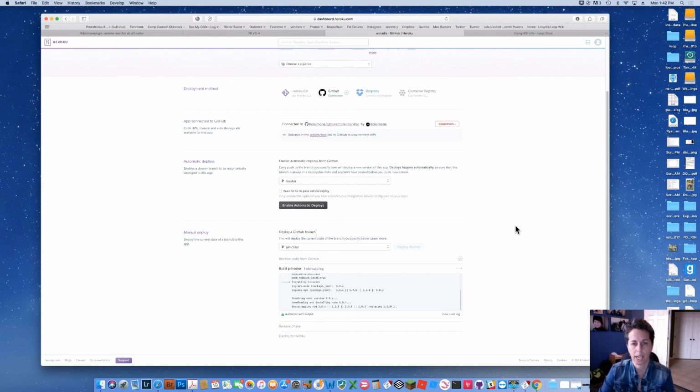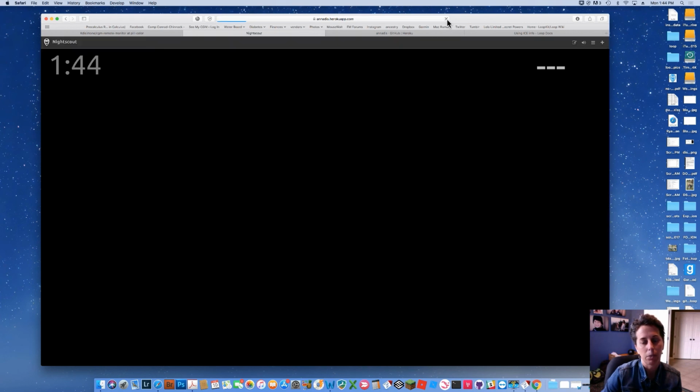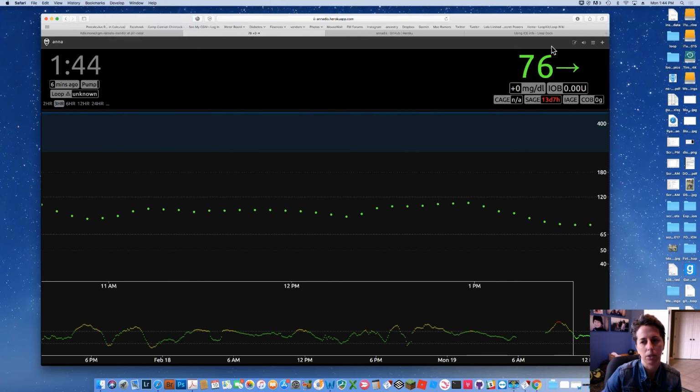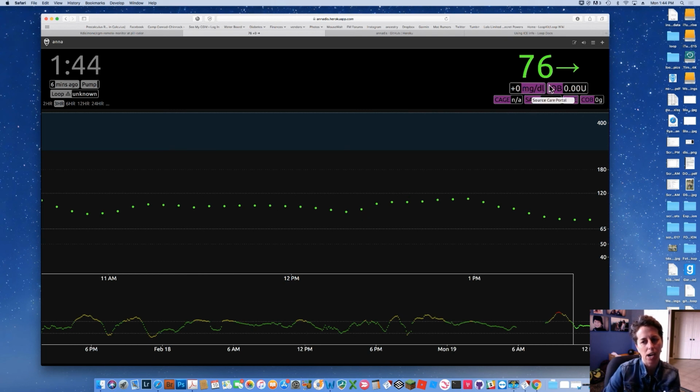So I'm going to just wait a sec. All right, cool. We have gotten a successful deployment. So now we will go ahead and take a look at how the site looks. That's the old way. We're going to refresh it. Or we might have to clear the cache. It might take a little bit to get back going. But voila, there are our updated pill colors. So that's pretty cool, pretty sweet, very easy to do.